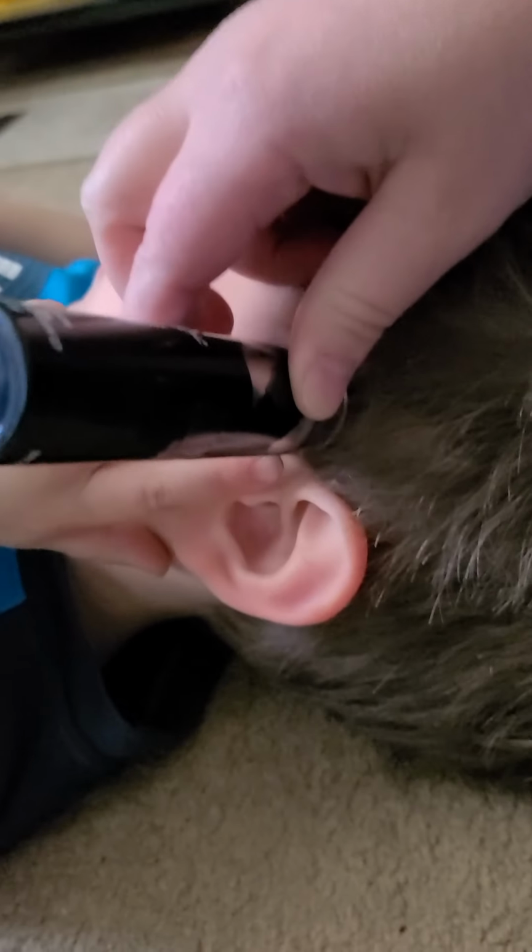The next window is the transtemporal window. That will be on the temporal aspect of the head, right here, kind of above where the ear is. I don't know if you can see where I am.